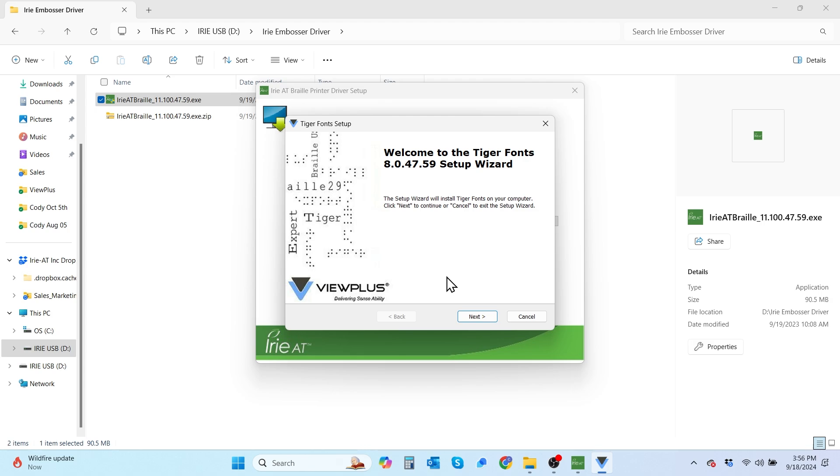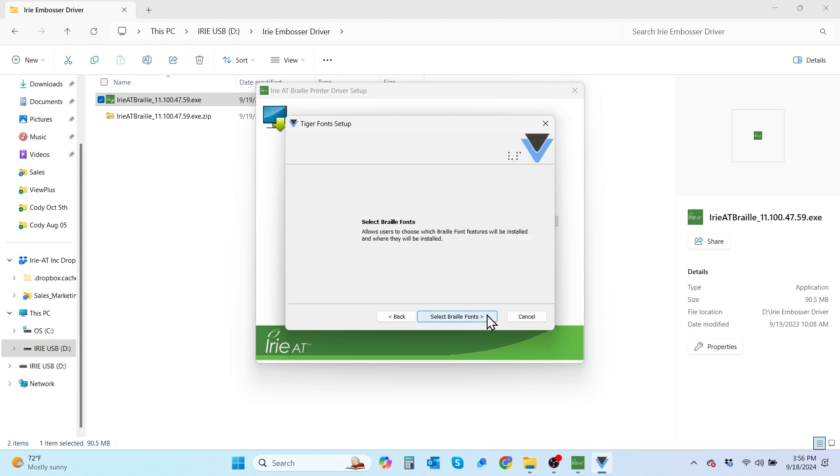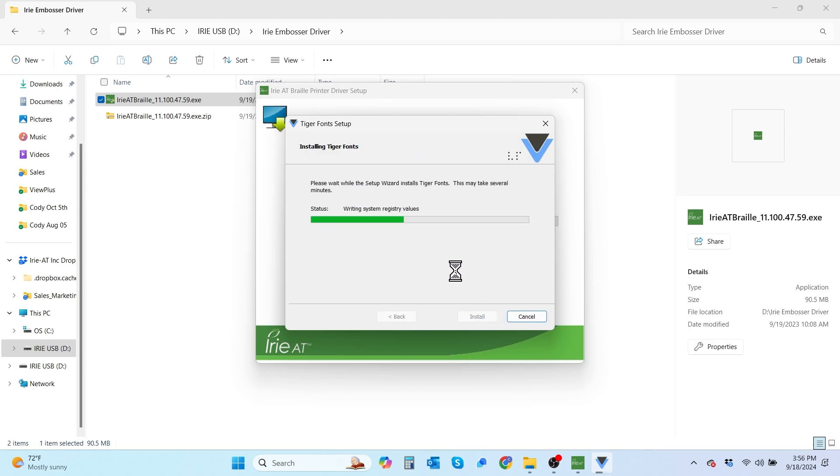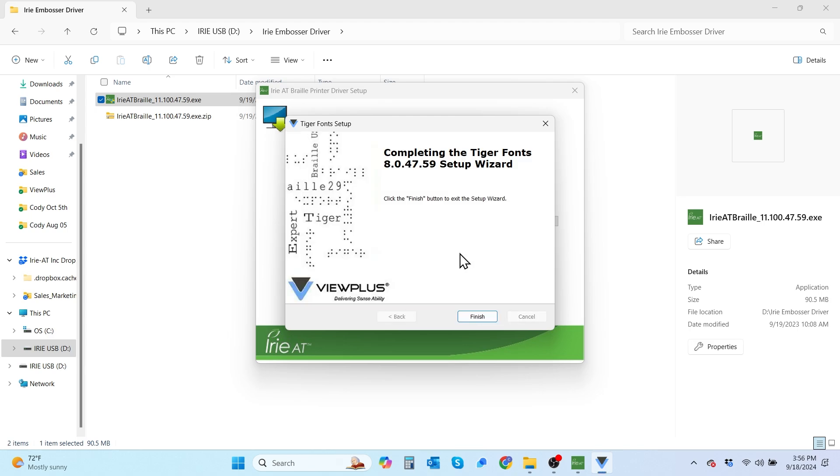Now we're at the Tiger Fonts setup screen. We're going to go ahead and select next to begin the Tiger Font setup wizard. Now it's going to ask if I want to select the Braille fonts — go ahead and select that option. For now, we're just going to select install all. Now it says that we've completed the Tiger Font setup wizard.